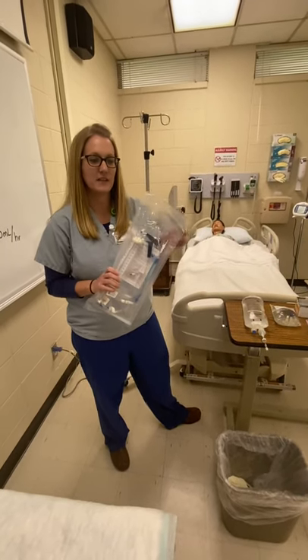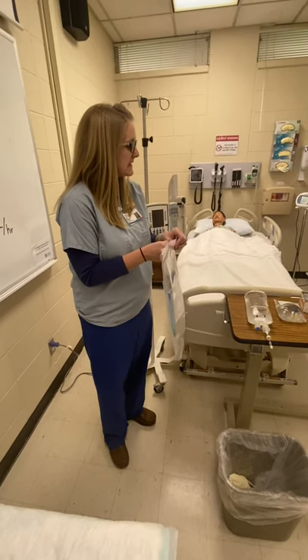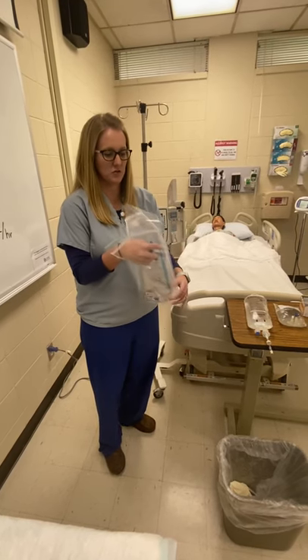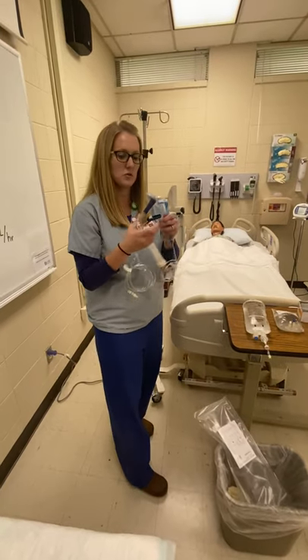Hi guys, this is a quick video talking about how to prime a buretrol. I know in the adult classes you have been priming regular IV tubing. In our PEACE course, I introduced you to what a buretrol looks like, and so now we are going to prime one.